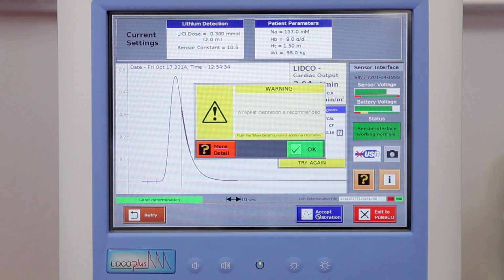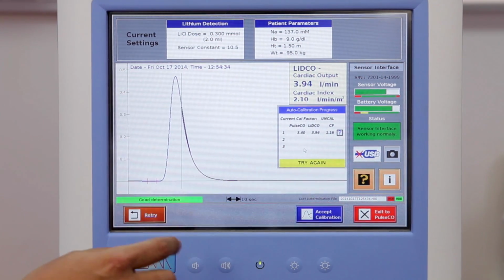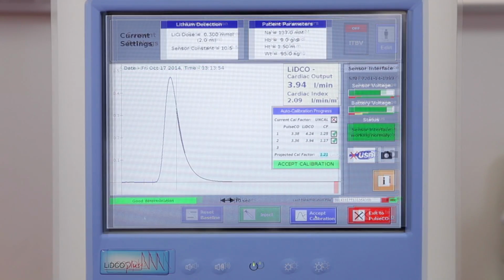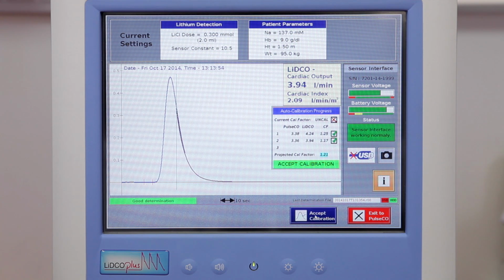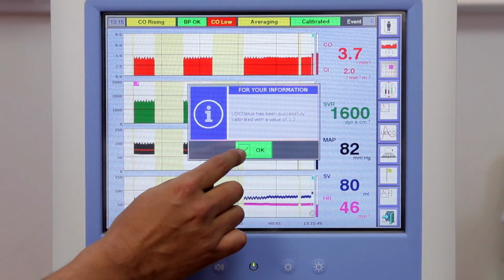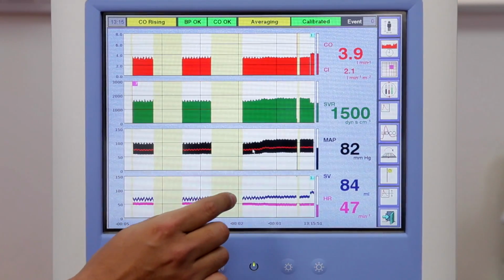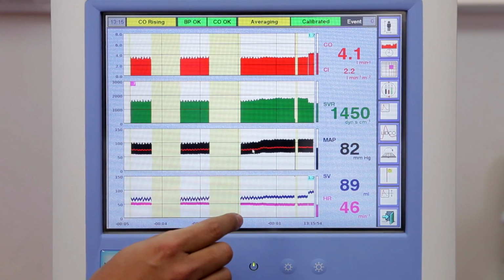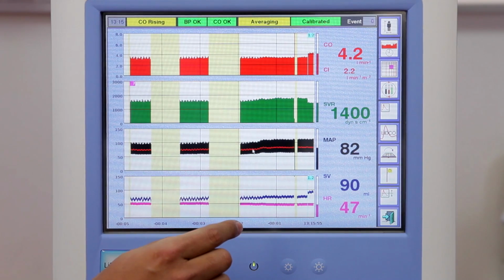Note, a second measurement will be requested if it is an initial calibration as shown. Press OK and select Retry and repeat the calibration. If the calibration factor is within 15% of the previous reading, press Accept Calibration. Press OK to return to the main monitoring screen. The LiDCO Plus will now be calibrated with highly accurate absolute data and will normally need recalibration after 24 hours.